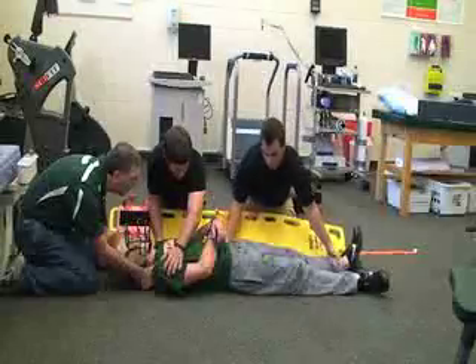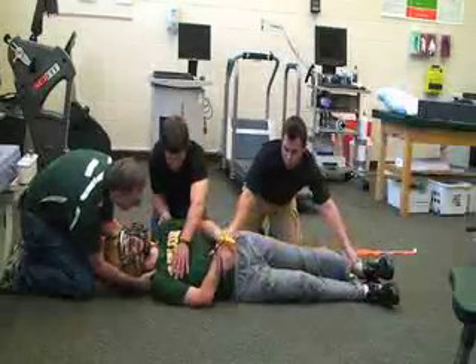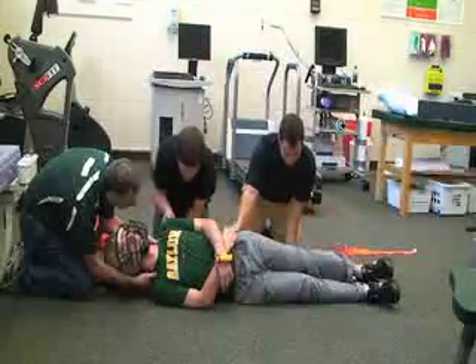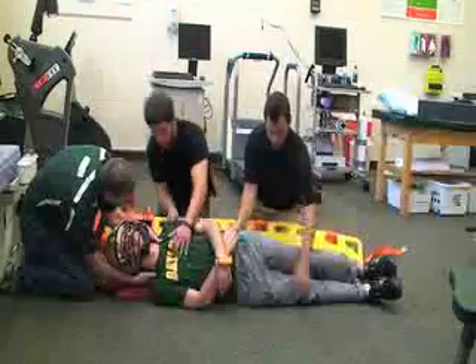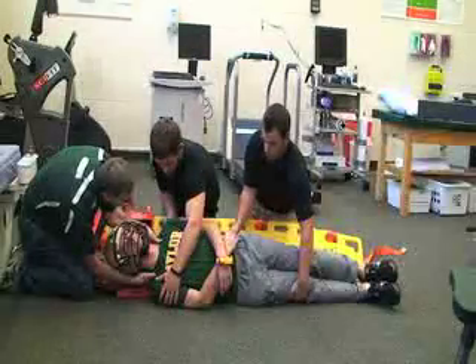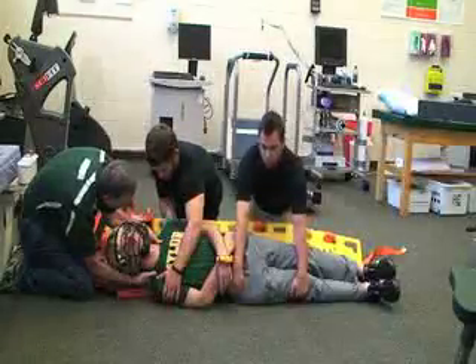On the count of three — ready? One, two, three — maintaining alignment. They're going to slide the board underneath. And again, on the count of three, we'll put them back down. Ready? One, two, three.